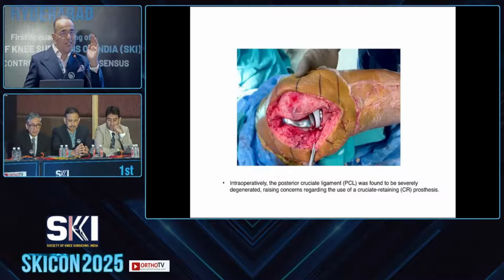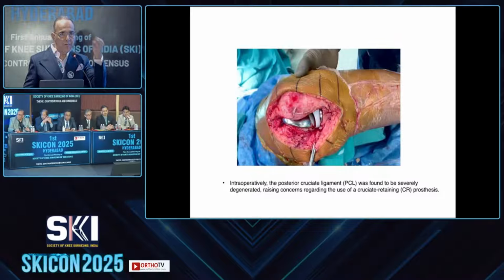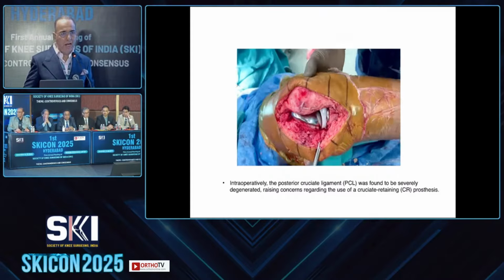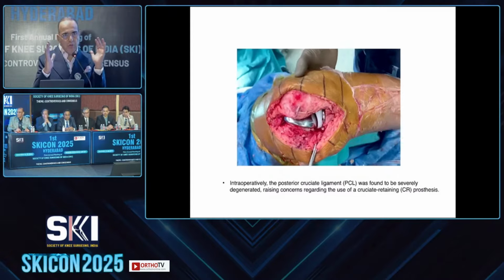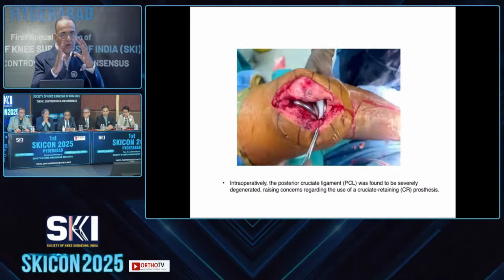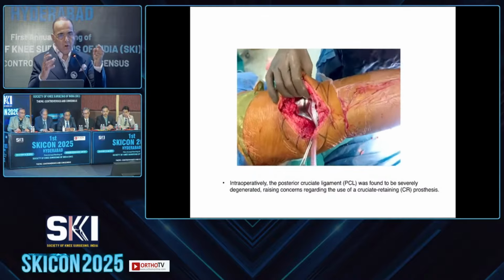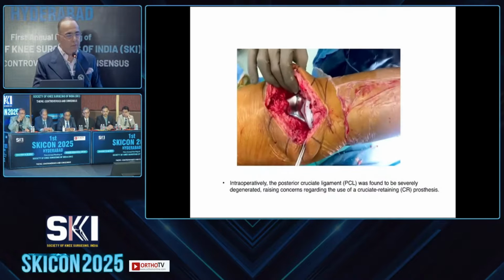So you can see there is increasing use of medial stabilized or medial pivot where the PCL is not intact. So you lose your anterior drawer, so you snug with an artificial medial pivot or a medial stabilized insert. That's the take home for 2025 and beyond, that we should be able to balance our knee in all three planes with either a CR or a medial stabilized / medial pivot and get a negative anterior drawer along with internal rotation of the tibia on the femur.